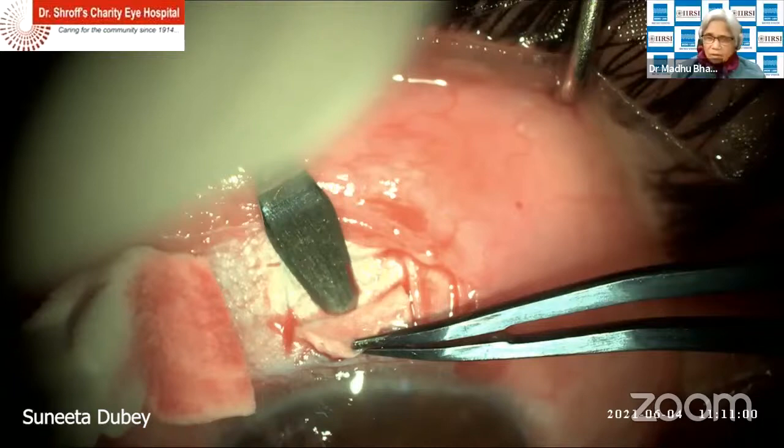And I think the point of using a crescent as well as a knife, the expense is an issue. Since we're talking about mitomycin C and Ologen, expense is again an issue. So if you don't have a set and you want to do a trab, you can still go ahead and do it. And triangular sponges everybody has. It's a very cheap one.